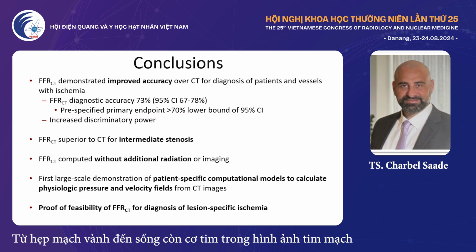So when we're looking at FFR, it demonstrates improved accuracy over just CT diagnosis, especially at 73% with a 95% confidence interval of 67 to 78%. The pre-specified primary endpoint is more than 70% lower bound. The FFR CT is superior to CT for intermediate stenosis.